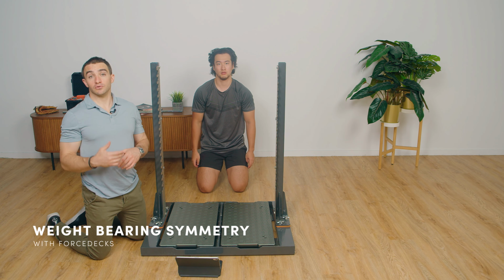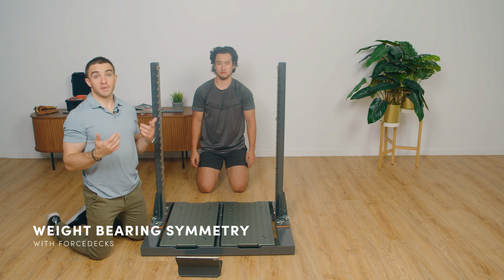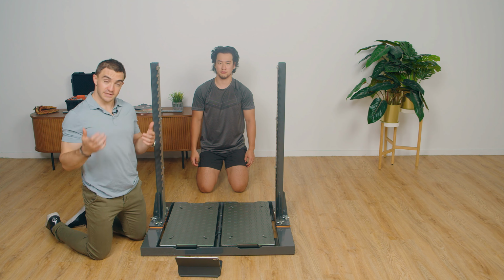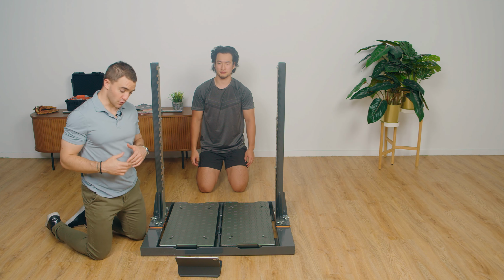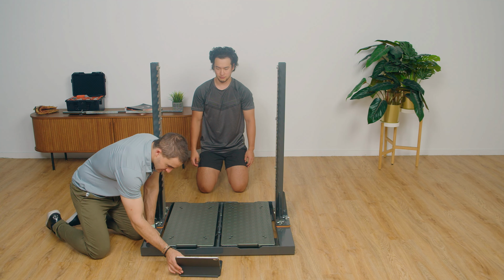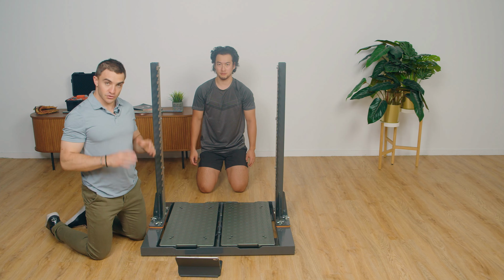Now, in addition to restoring range of motion and strength, the other thing we want to restore and improve is a patient's ability to tolerate and weight bear through their upper body. So a nice easy way to do that is quantifying that using force plates. So what I'll do is I'll set them up just using the force trace for any test, and we can progress from kneeling into a normal push-up position.